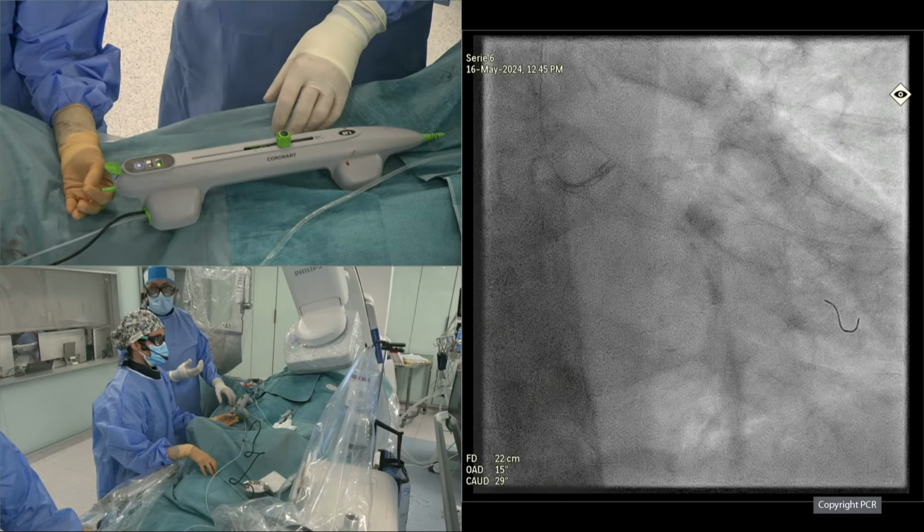This is fine. So now the brake is on. We are in glide assist, so I'm going to change again to the ablation. And we release the brake now. Look at my hands, because it's an entirely different technique than rotational atherectomy. This is very important. Look at the speed I'm making the backward sanding. Okay, I start sanding now. You can hear the sound, and look at the speed. You probably barely see my hands moving.